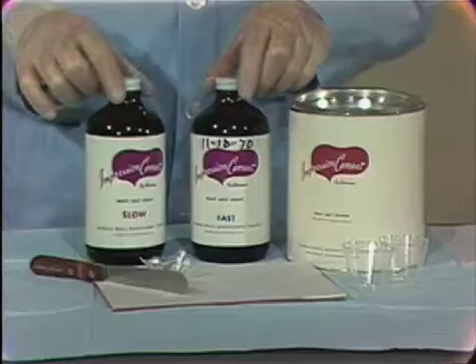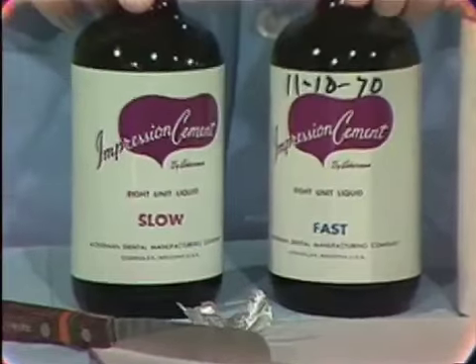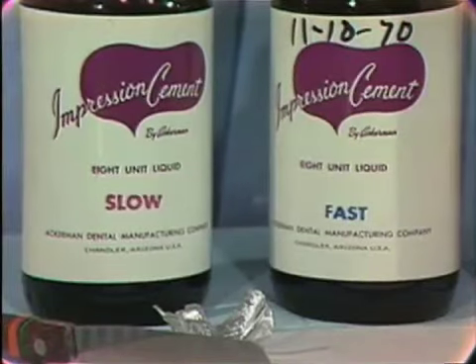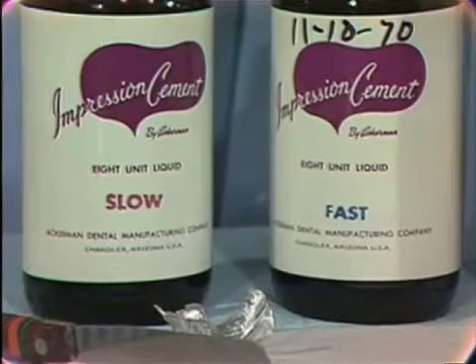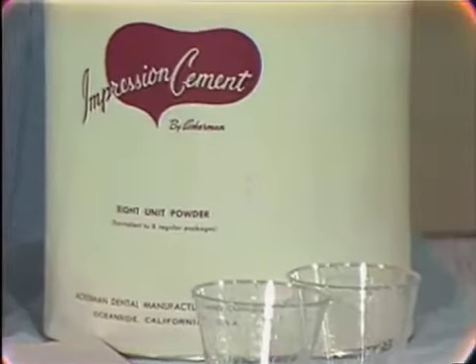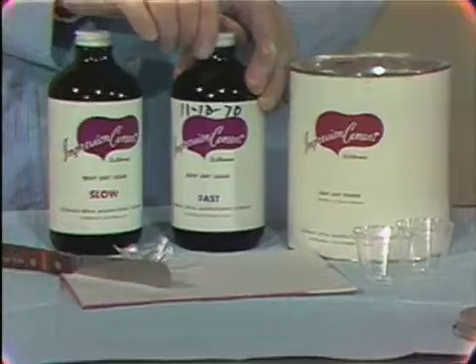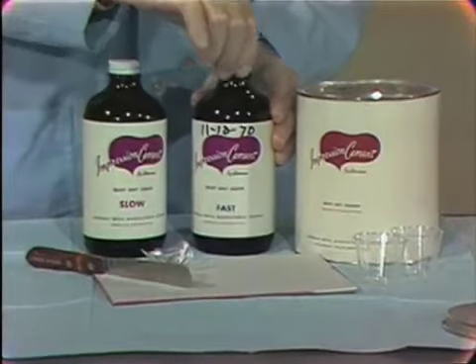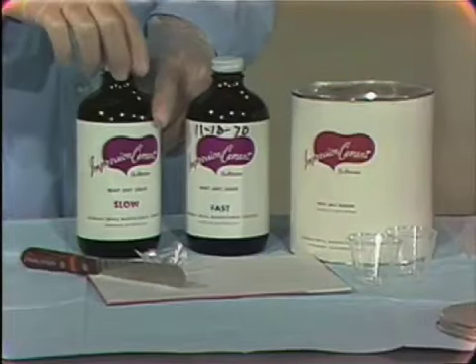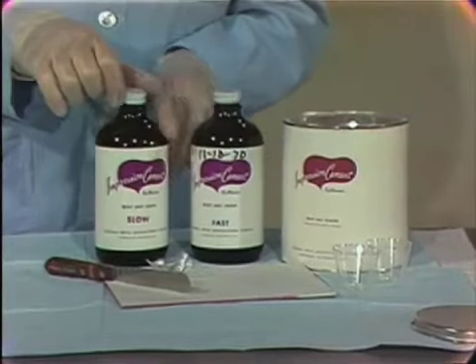The material that we use that fits this requirement is the Ackerman's impression cement that is specifically designed for this procedure. It is a very fine mesh powder. It has tremendous flow properties. One of the difficulties in having material with tremendous flow properties is that it runs all over the place. You should protect the patient adequately with towels to keep from getting this on the clothing, and you should have yourself protected. I'm wearing rubber gloves now because this material sticks to the tissue if the tissue's dried.